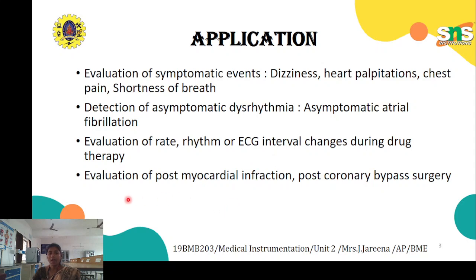Finally, we have evaluation after myocardial infarction and after coronary bypass surgery. After surgery, the patient is kept under observation to check for any side effects or discomfort after the surgery.